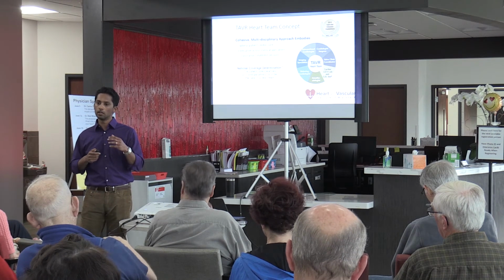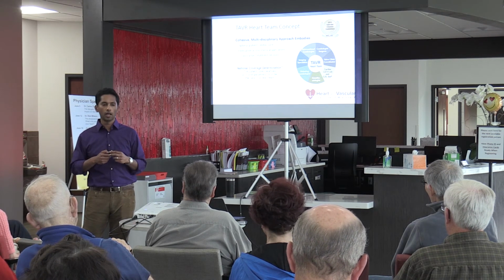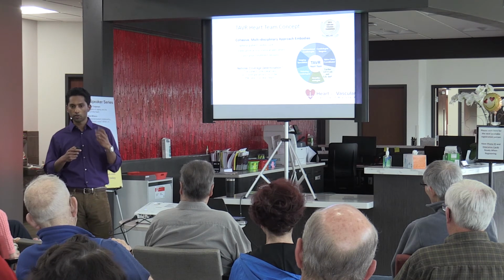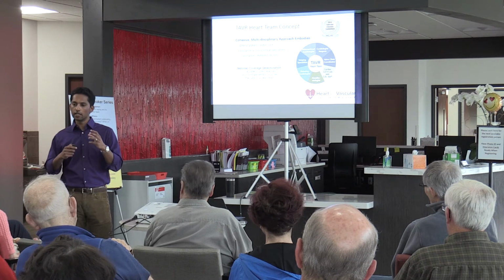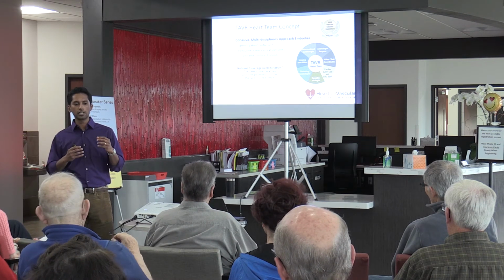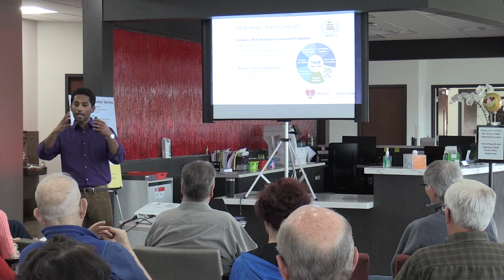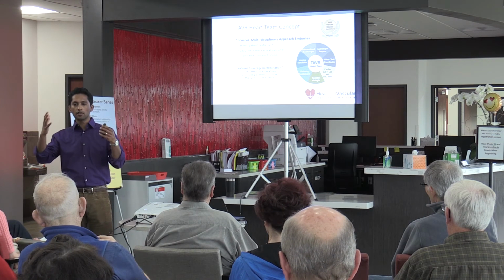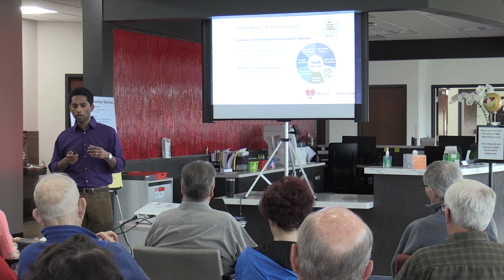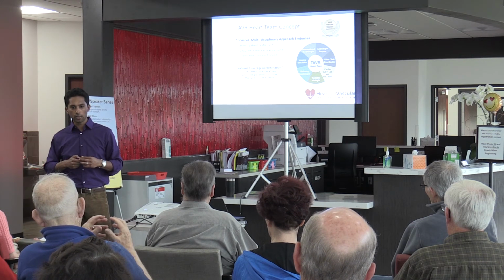But I think more and more we're seeing the majority of places treating bicuspid valve patients with the minimally invasive technologies. Part of the problem in trying to treat those patients is that we talked about the patients with bicuspid valve aortic stenosis tend to be younger, like we said before, because it's got 2 leaflets instead of 3. So those leaflets tend to have less calcium on them. They tend to be not as thick. And part of the problem, at least with some of the technologies used for TAVR, is that the valve depends on that calcification and that thickening to anchor itself where you put it. And so if you've got a valve that's much smoother, much slicker, less calcified than your traditional valve, that can sometimes present a problem, where you don't have an adequate surface to anchor the valve the way you need it to. So certainly that's one of the issues that we face with treating bicuspid valves.